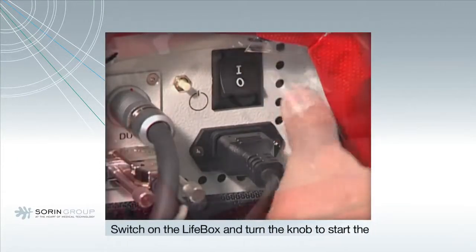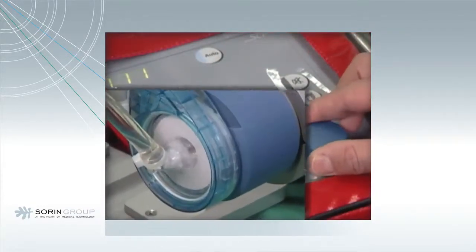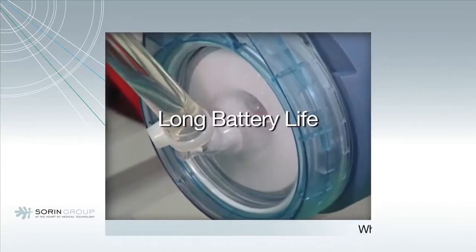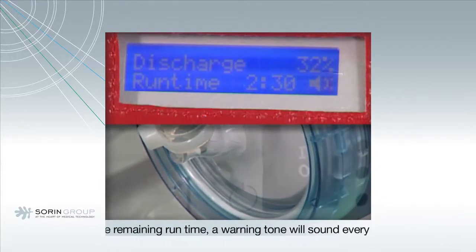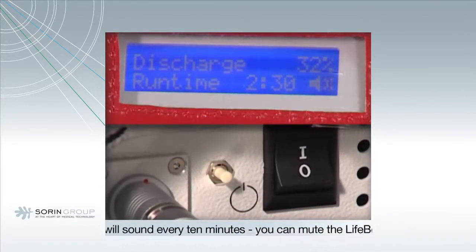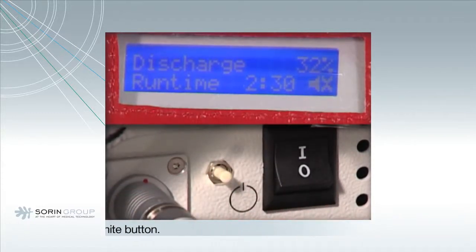Switch on the LifeBox and turn the knob to start the pump. When running on battery, the display shows Discharge and the remaining runtime. A warning tone will sound every 10 minutes. To mute the LifeBox, the white button must be pressed and the loudspeaker symbol will be crossed out.